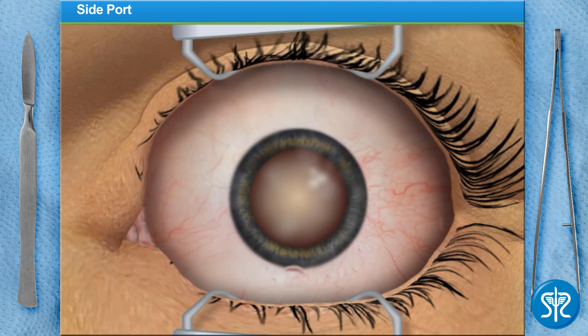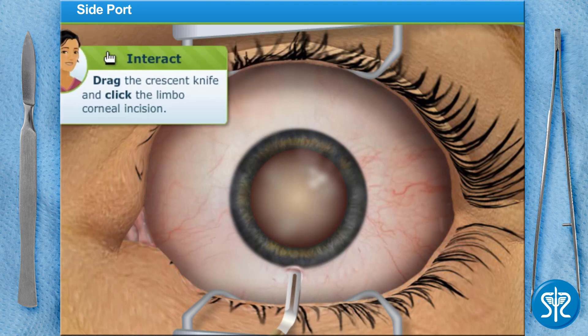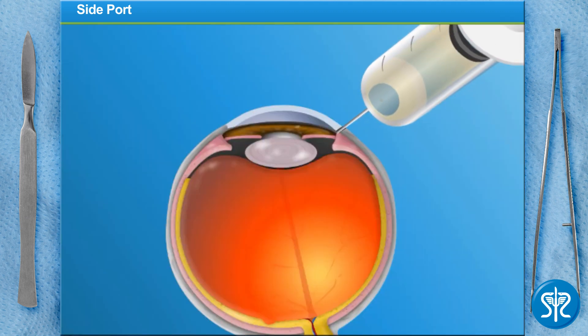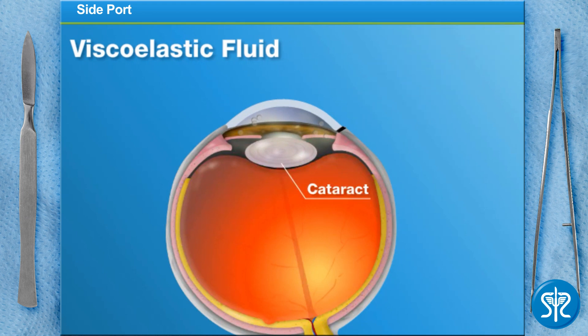Next, we use the crescent knife to make a corneal tunnel into the anterior chamber of the eye. A thick, transparent viscoelastic fluid is injected to fill the space between the cataract and the delicate underside of the clear cornea in front of it. This is done to keep the cornea from collapsing during the procedure.